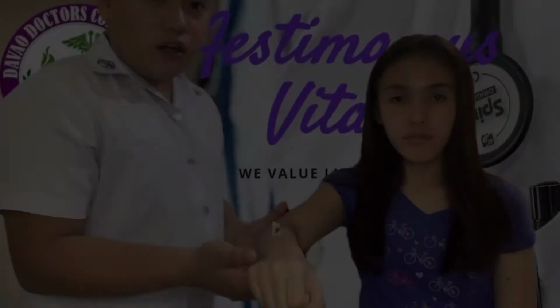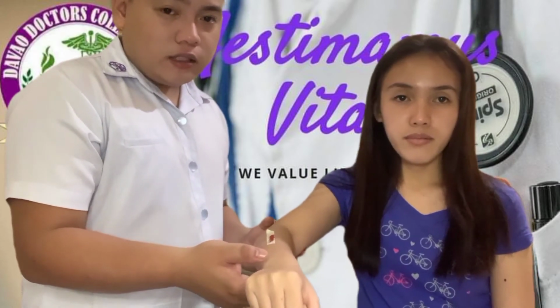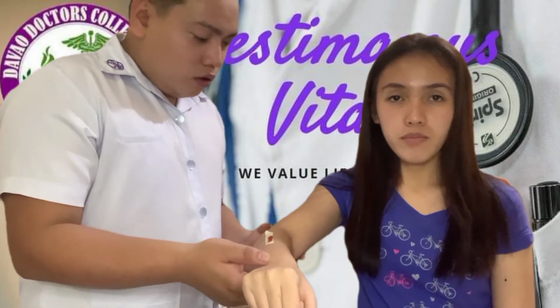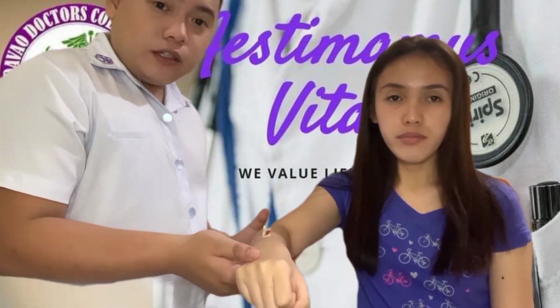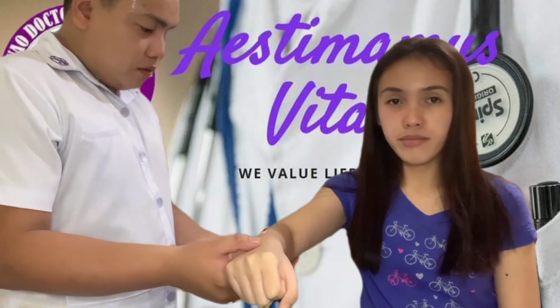Yes, please. You can speak to the patient, ask the patient to hold or support this part. Ma'am, hold on to this part.